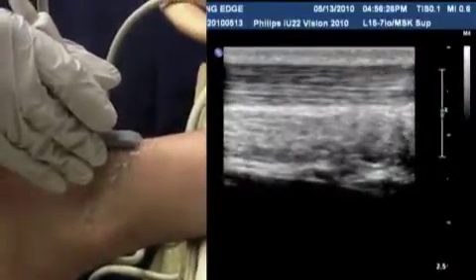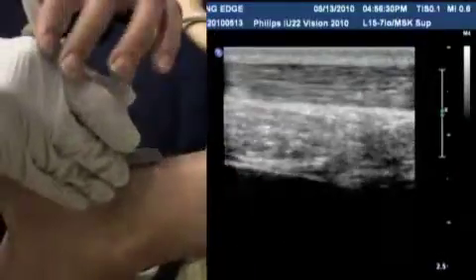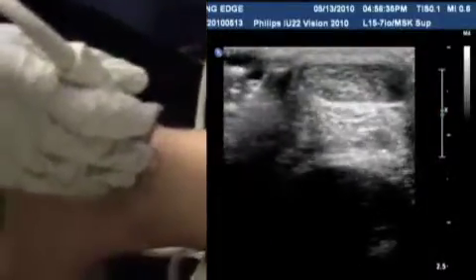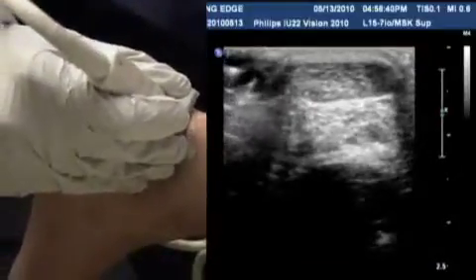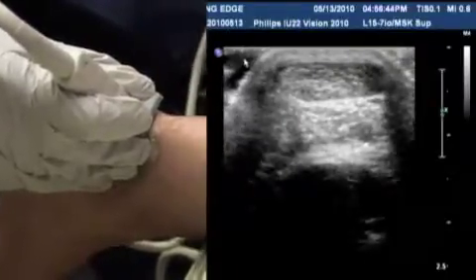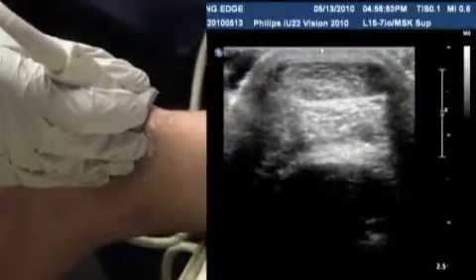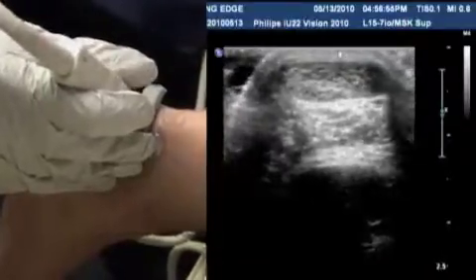Usually I call it going from a 12 o'clock to a 9 o'clock position for the probe position. As we turn transverse, you will see the tendon appearing oval, and you have to center the probe over the tendon because the tendon can be a little off axis. What you also see on both sides is a dropout of echoes, and that's normal because the probe is not in touch with the ankle, since the tendon is pretty narrow compared to the size of the probe you're scanning with.